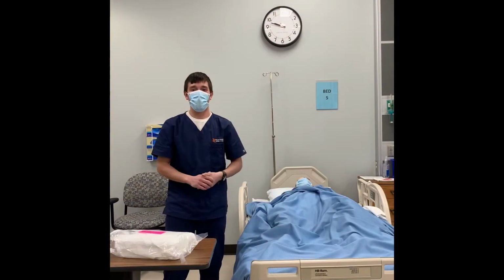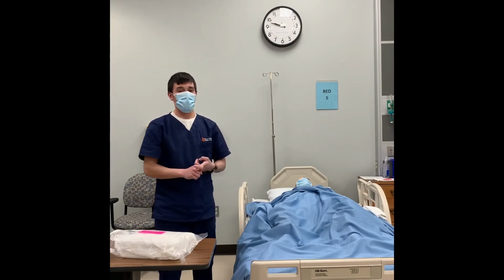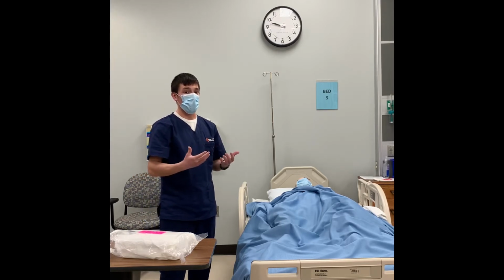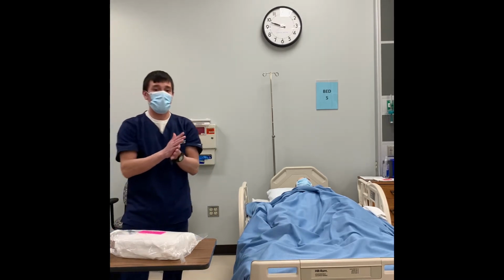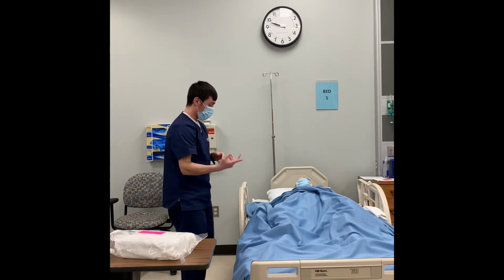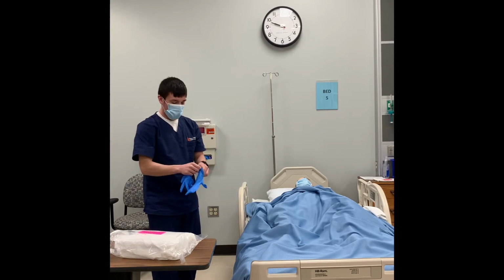So today we are going to insert a Foley catheter. The first thing that we want to check is the provider's orders and make sure that there is an appropriate reason for our Foley catheter. Next, we're going to walk into the room, perform hand hygiene, and then I would identify myself and ask the patient for 2 identifiers, their name and date of birth, and then I would double check with their wristband. From there, I would make sure that I have my gloves on.